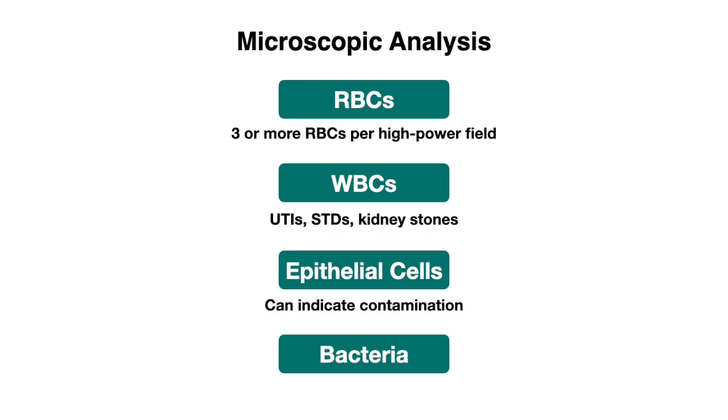And finally, bacteria is something else that we see on microscopy. It can be present with both an infection as well as contamination, as we just mentioned, so it's important to look at the symptoms of the patient as well as the other values that are present when making your diagnosis.